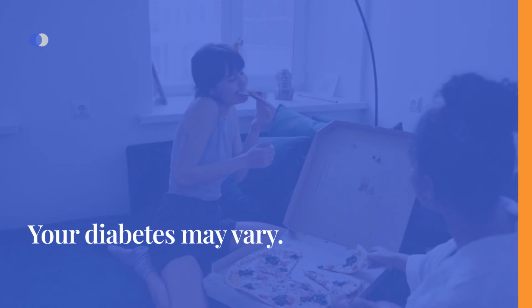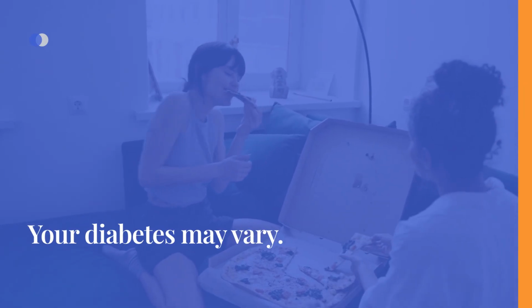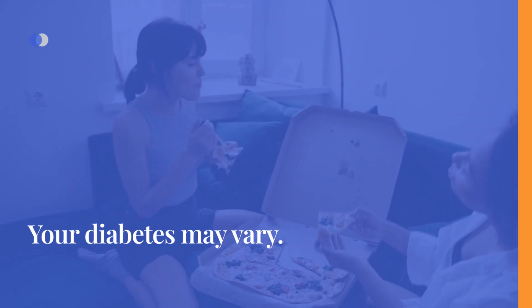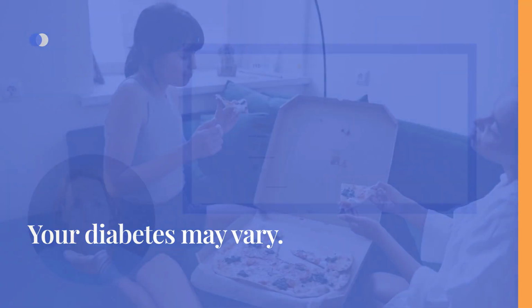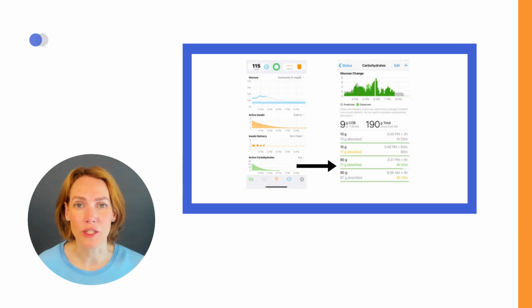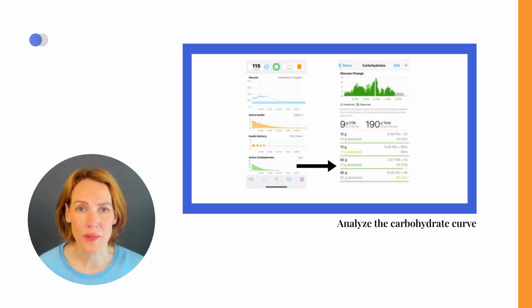It is important to note that individual experiences with diabetes may vary, so these guidelines serve as a starting point and may require adjustments based on personal needs and responses. After the meal, you can monitor in the carbohydrate curve if the observed glucose change aligns with the predicted glucose change. By analyzing the carbohydrate curve, you can gain insights into the effectiveness of your approach to managing a high-fat meal with Loop.